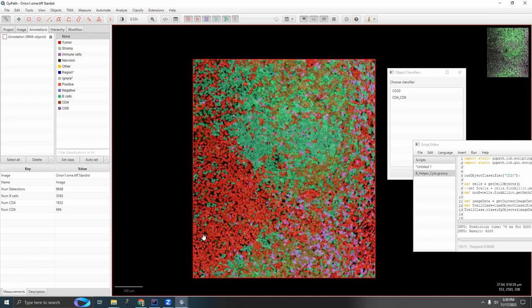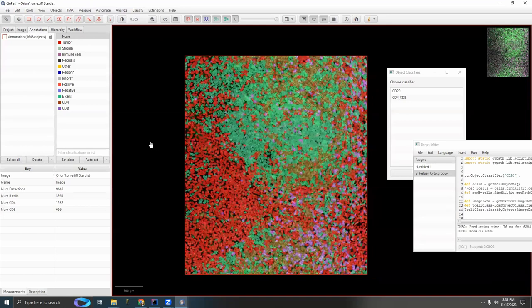This is a convenient script for cleaning up your final results, but I do want to caution that it can be dangerous to do something like this. When we saw the messier results, the ones that we had known mistakes, we could at least get a sense of the magnitudes of the errors. We knew that there must be something wrong that I was finding CD4, CD20 cells, but in this case, we just magically don't see it. Which certainly does not mean that suddenly my segmentation is so perfect that there's absolutely no artifacts. It's just not in our data.